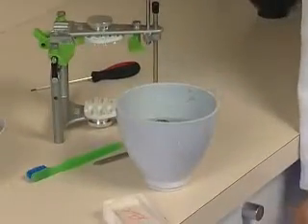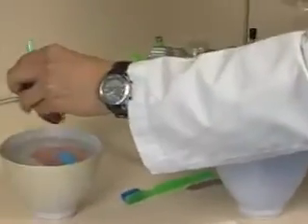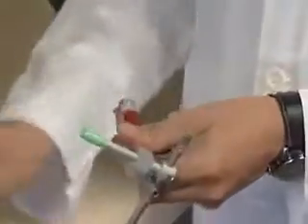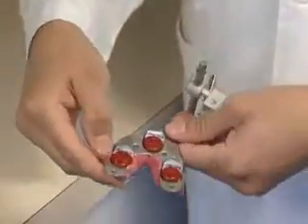Okay. He has to prepare his bite fork. And we want to take off the Beauty Pink Extra Hard off of the lower and just break off the edges of it a little bit. Turn it so it sees it. Turn it toward the camera.